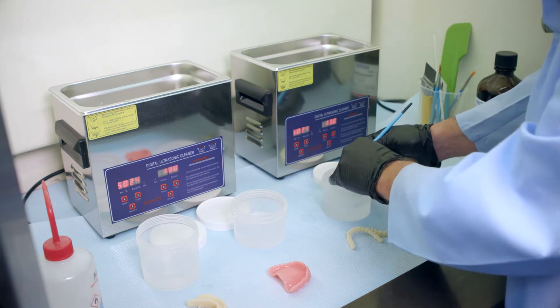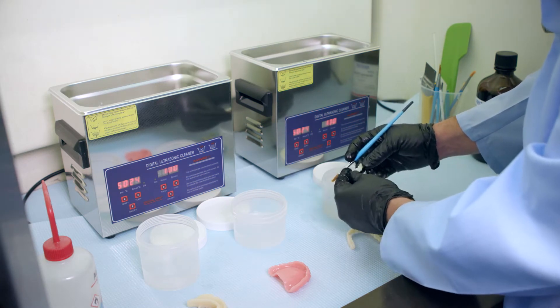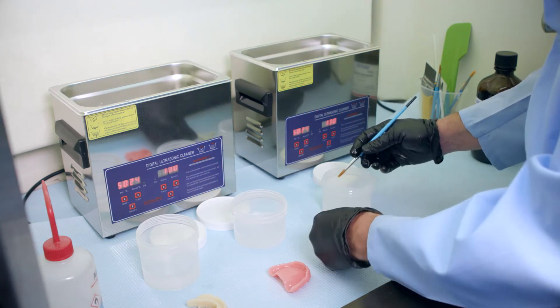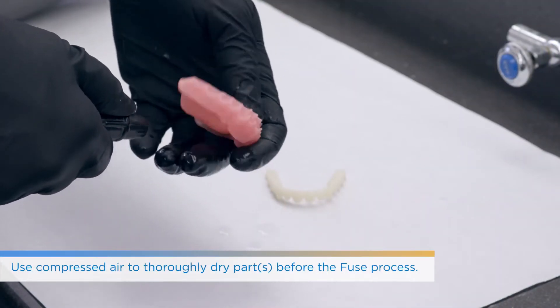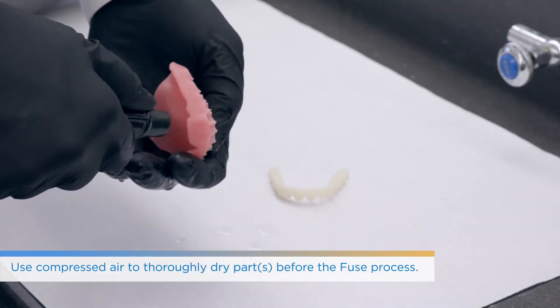Remember at this point it is still uncured resin, so gloves are key. The oils in our hands can actually affect the overall finish of these materials, so be sure to wear your PPE. That's been the clean stage.